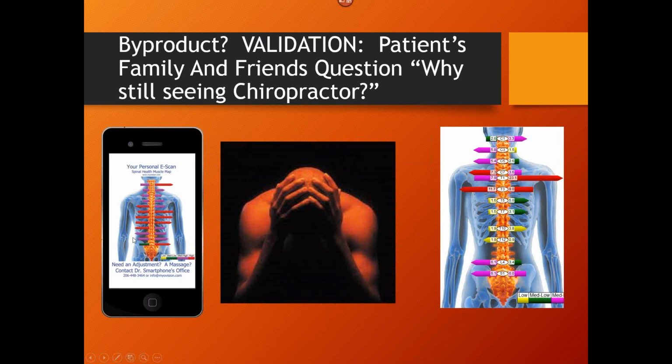But what's more amazing about this is the fact that we forget that in the cash world, in our cash practices, they have people at home that are very skeptical about what chiropractic is. And I was shocked at how many people said, wow, the value of this in showing why I'm still here is important. This is for the cash patient or one who's converted after a PI injury or whatever reason they came in to see you. They want to still see you for health. It's really valuable. They also take this and post it on Facebook. It's an electronic business card for you, but they would show it to their friends and family. They go to have dinner after seeing you and they pull it out and show their friends how cool their chiropractor is, and you can change this message to say whatever you want. Very cool features of eScan.